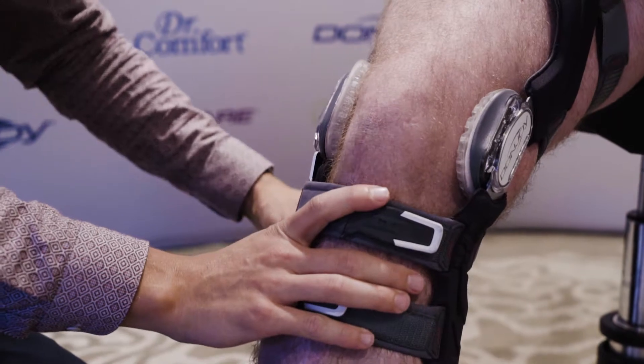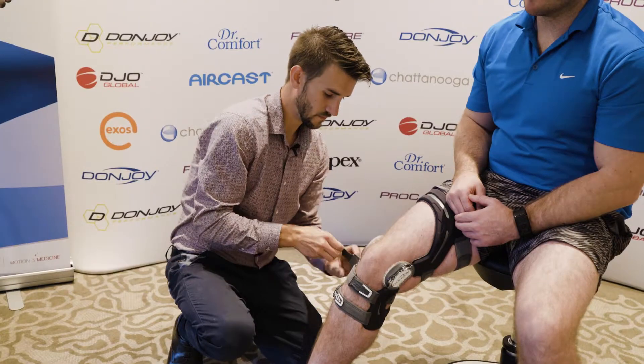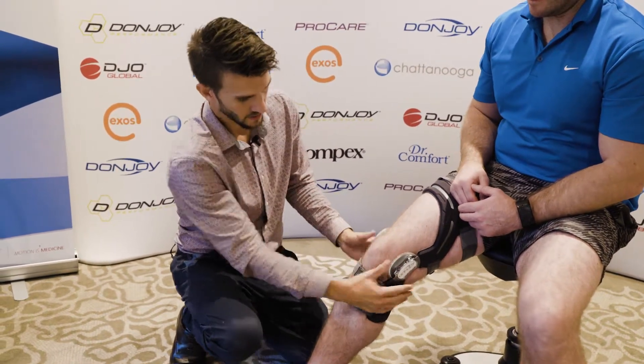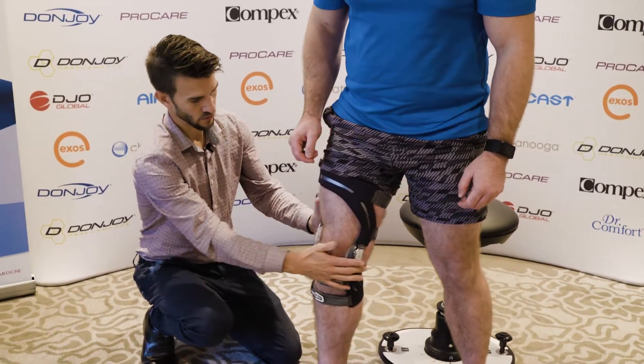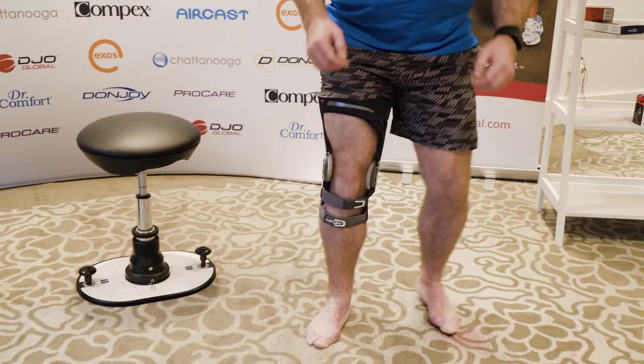Then lock it in with the last one just behind the knee. Making sure that it's sitting far enough back, get the patient to jump into standing and make sure it's sitting well through the middle of the knee joint. Then get them to walk around, squat, and generally get a feel for how it looks and fits.